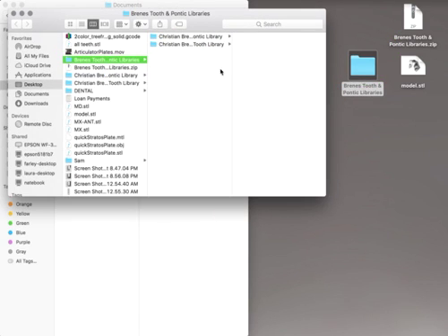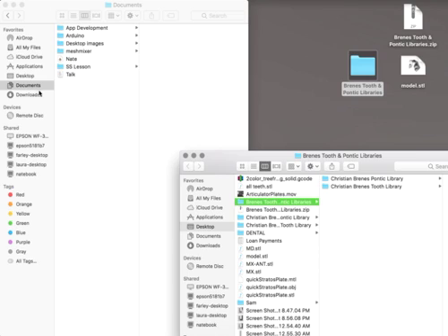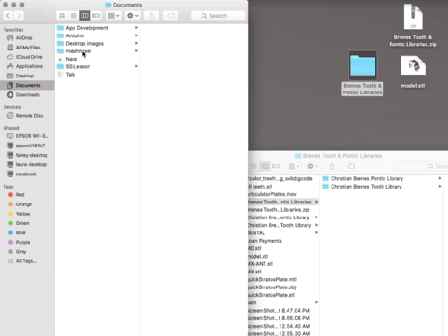One for the Pontic library and then one for the Tooth library. You're going to go to your computer, and this is going to be the same on an Apple or a PC, but you're going to find the documents folder. Inside the documents, there's a folder called MeshMixer.